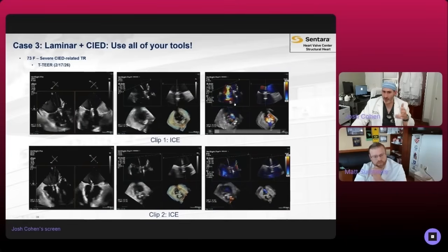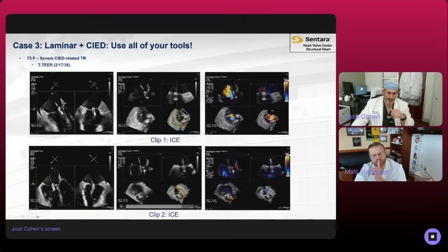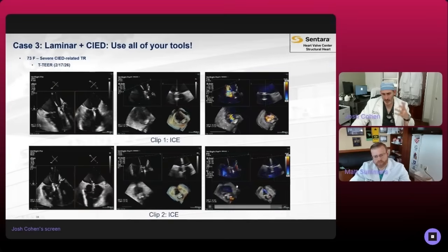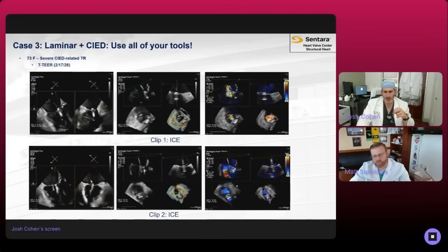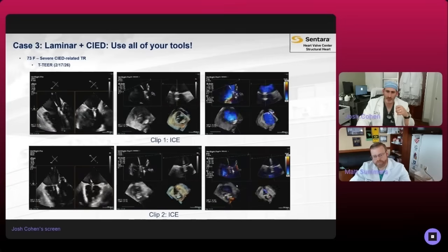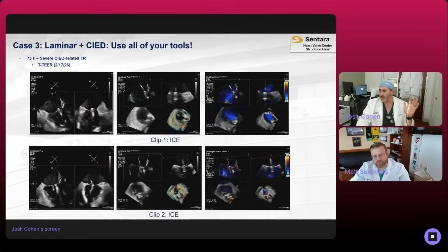This is after that first clip. There's TR, but it's not anything like it was before. Again, we were encouraged by that, especially because it's kind of in this one place. We go back with a second clip, get a really good grasp, and have again trivial TR even by ICE there. So use all your tools. You saw that we went and confirmed in the transgastric, right? We're up and back. The last thing we want to do is not be sure, and sometimes that happens. But when that happens, we've exhausted all of our other tools, and then we know we're not going to see it better in any way.